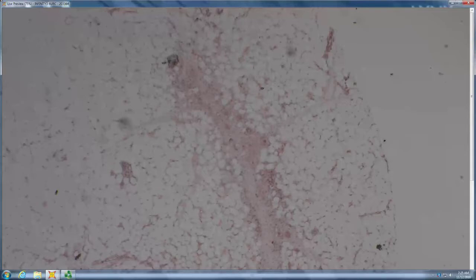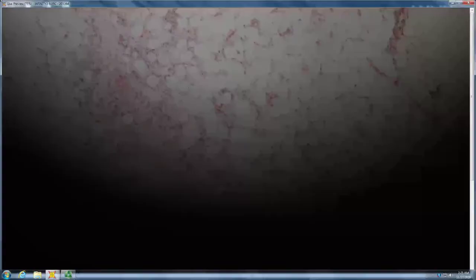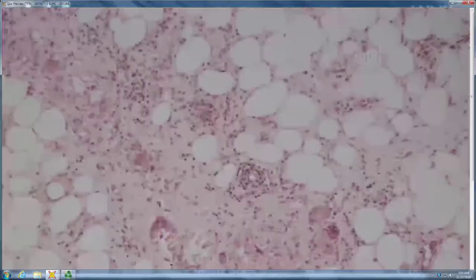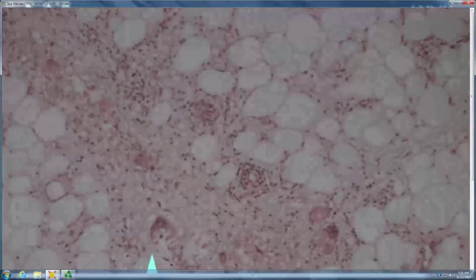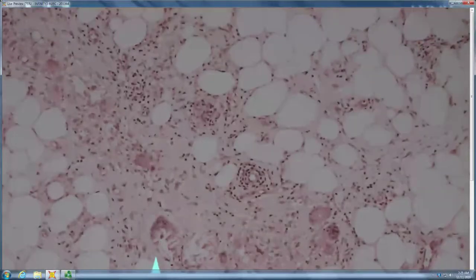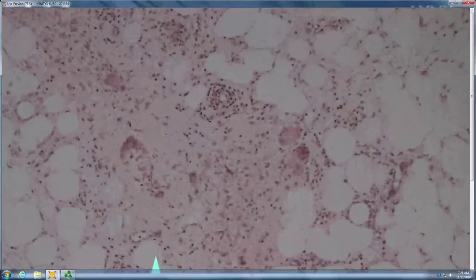Good for inflammation in the septum. It's kind of extending. So it's definitely weighted to the septum, and the lobules tend to be all similar in size and shape, right? So it does not look like there's necrosis of the lobule. And in the septum, you have granulomatous inflammation, and within the giant cells, you have these clefts. That's a Miescher's granuloma, which tends to be pretty good for what?